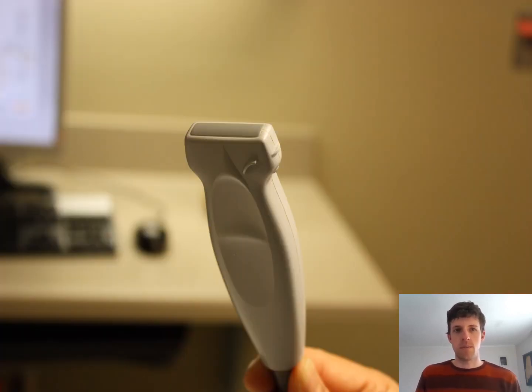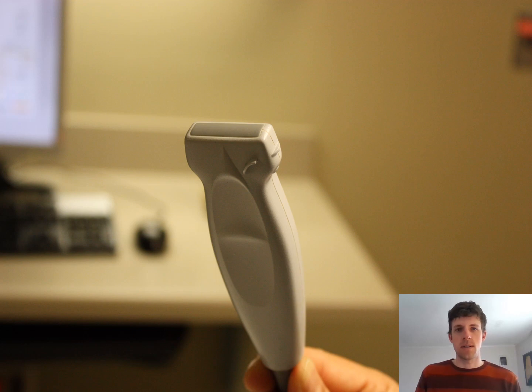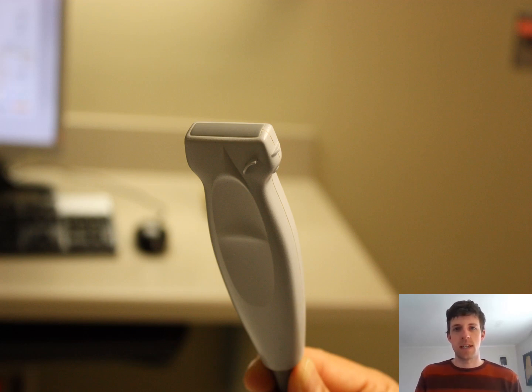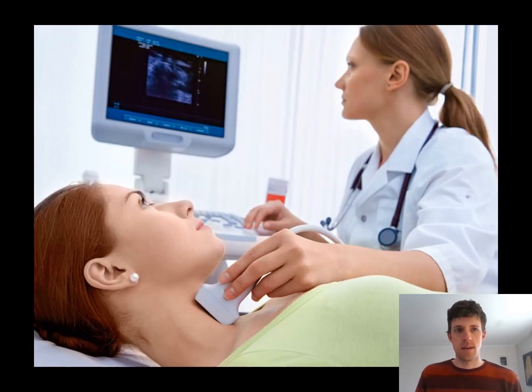First off, the probe you want to use is the high frequency linear probe. This will give the best resolution for identifying the superficial structures of the airway.